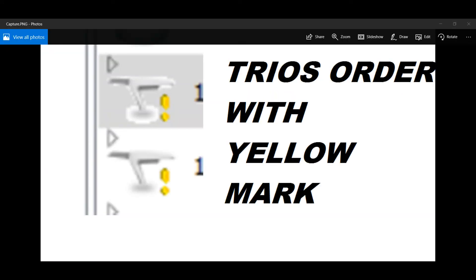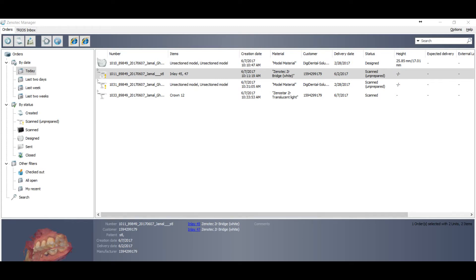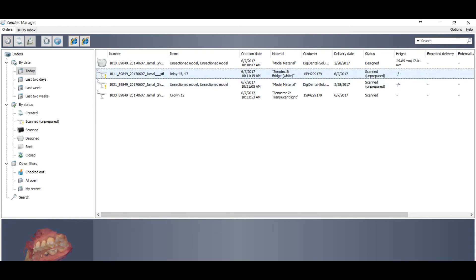So I will show you another easy way to convert if the doctor has selected some restoration and you receive the order with a yellow mark. Just right-click and go to Design.